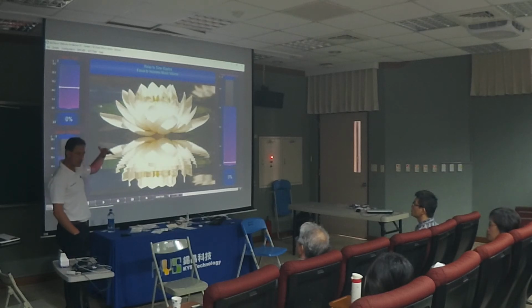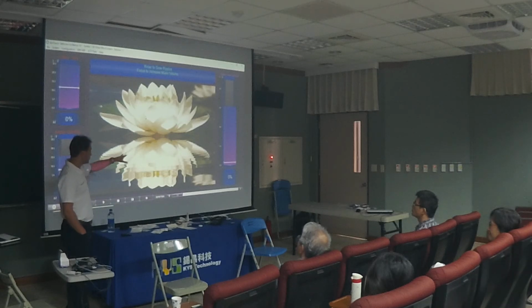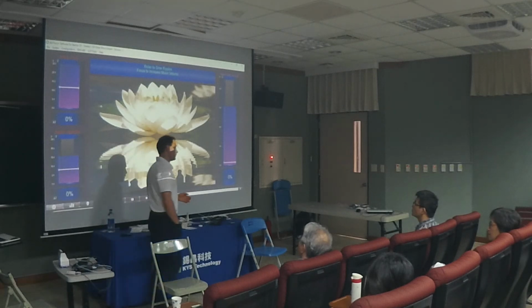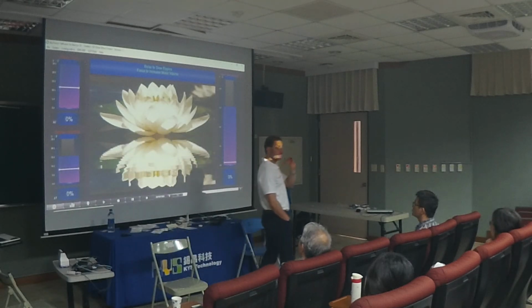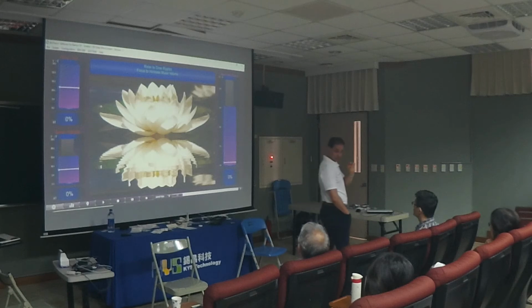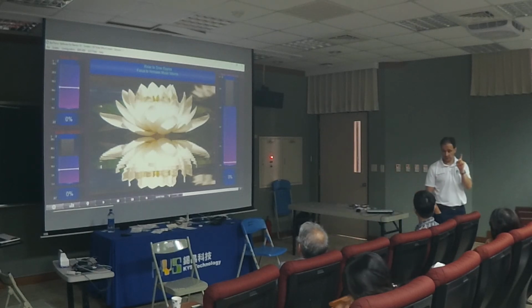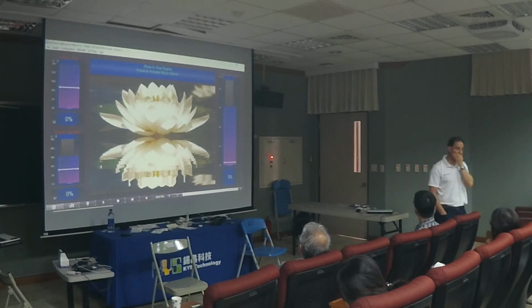So the more relaxed the client, the more the water is still. Now, you can use the visual, or you can add music to this. Okay? How do you know? Well, I always say start with something simple and easy to use. Start with one feedback. So in this case, use the water for a few sessions. If the client is better, start combining the feedback, the music with the water, for instance.